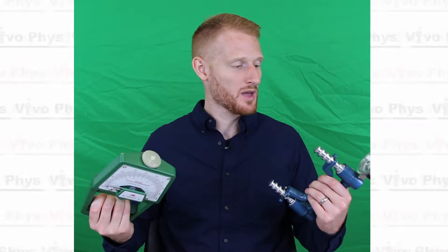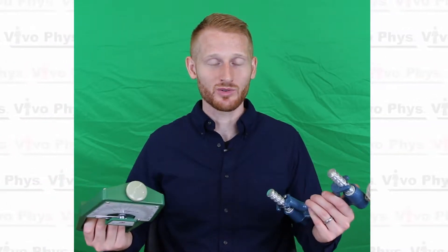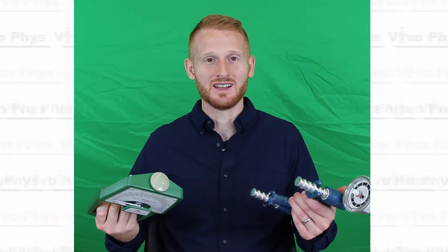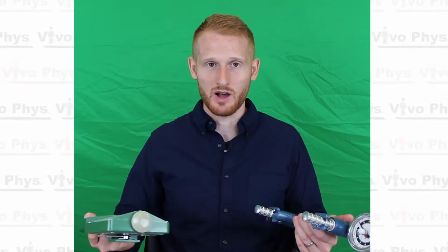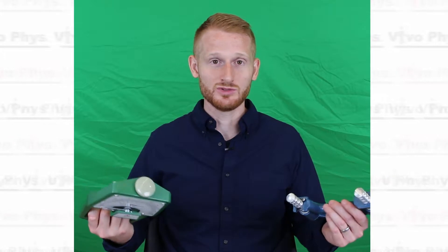Hand grip strength is correlated to the muscle strength of other muscles as well as other actions of the body. So even though you're only measuring hand force, you are actually getting at least an indirect estimate of how strong somebody is, sort of total body wide. Of course there's some critique to that, but they do generally correlate.